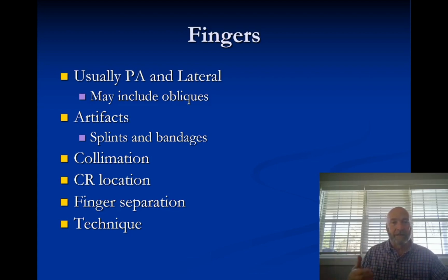Your understanding of that and my understanding of that are going to be two totally different things. So I can teach you what I would shoot a finger, a hand, a humerus with, but that's going to have very little bearing on you. What you need to do is settle and reconcile these kVp and mAs values in your mind for what you see in patients at any given time. So technique's tough to teach.